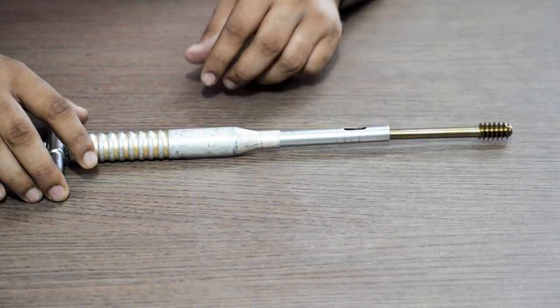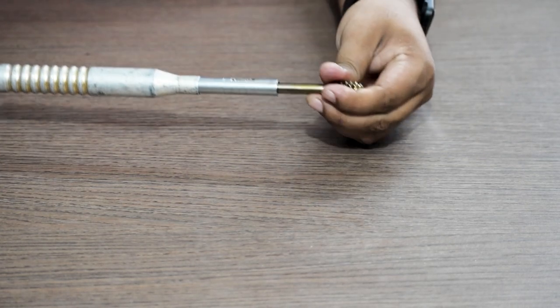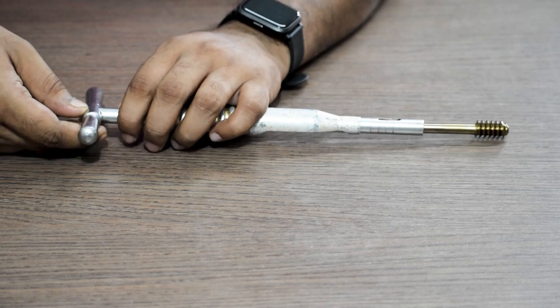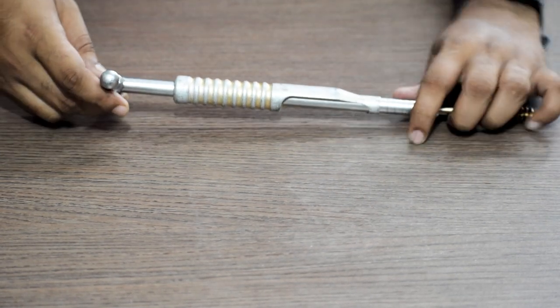And then we remove the lag screw slowly. We use the guide shaft so that the lag screw does not get stuck inside anywhere and it comes out smoothly.